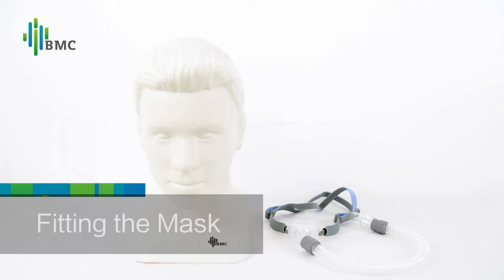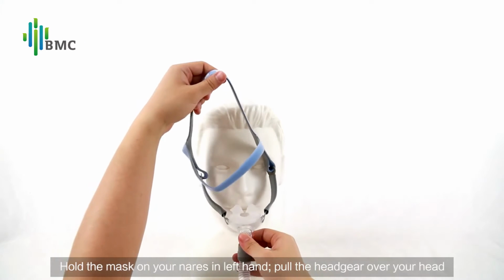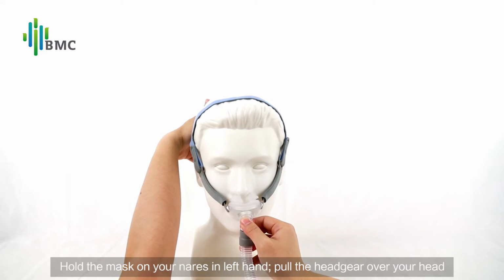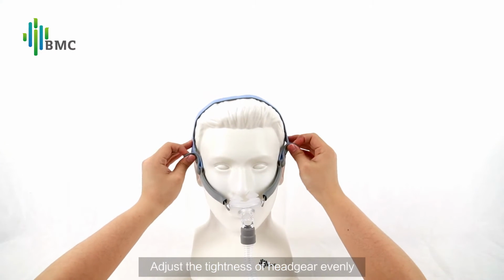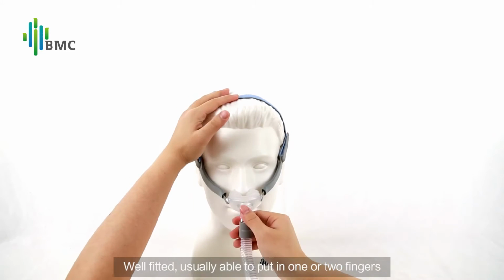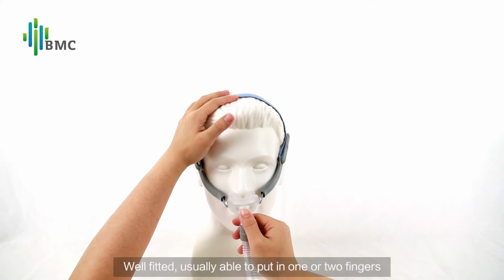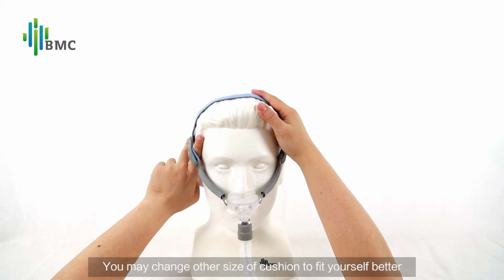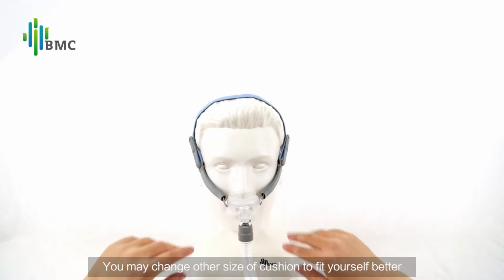Fitting the mask. Hold the mask on your nares in left hand. Pull the headgear over your head. Adjust the tightness of headgear evenly. Well fitted. You're able to put in 1 or 2 fingers. You may change the other size of cushion to fit yourself better.